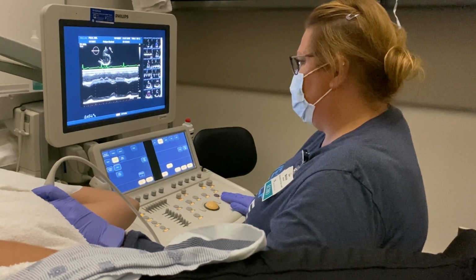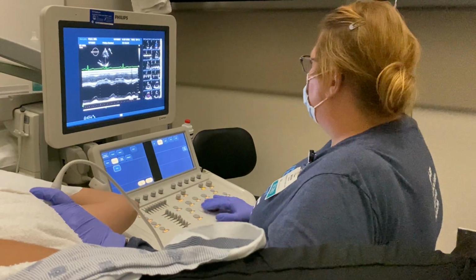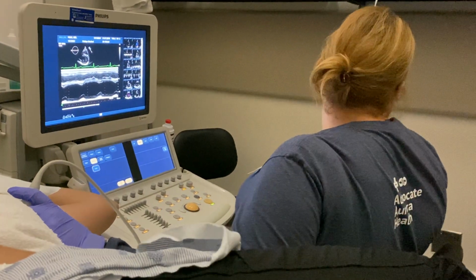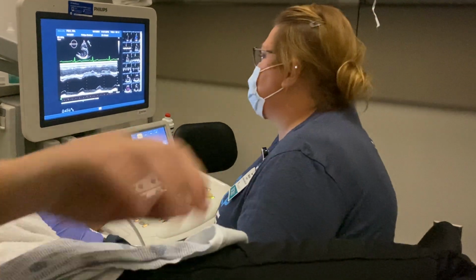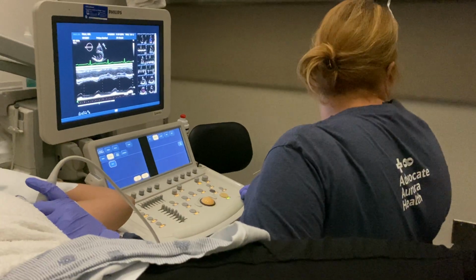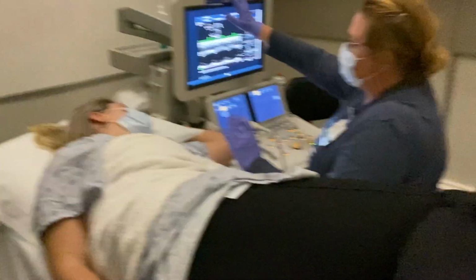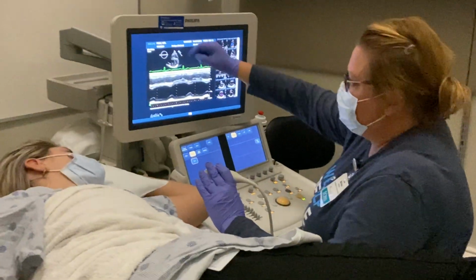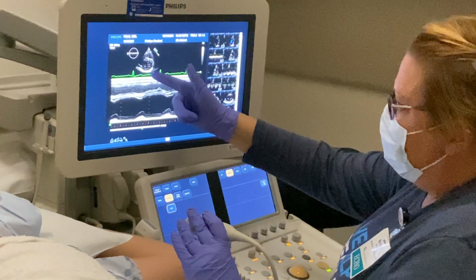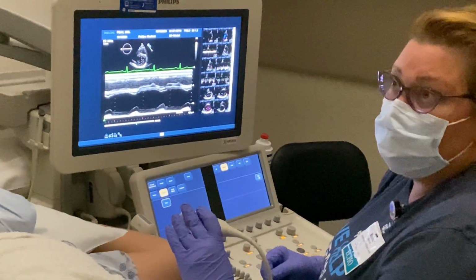So the cursor doesn't have to be through the mitral valve? Not through the mitral valve. For other stuff it can be. Okay. But for your competencies and your test out, we want an M mode at the mid-papillary level. Okay. So on here again, it's one-dimensional information. So we follow the cursor line on the 2D image to know what we're looking at on the M mode image.